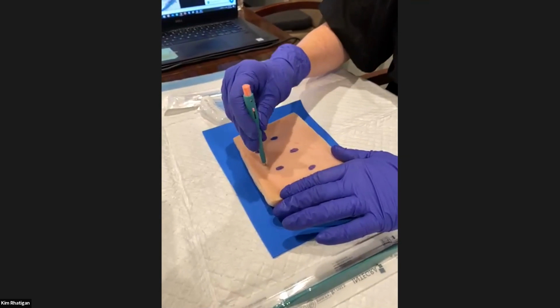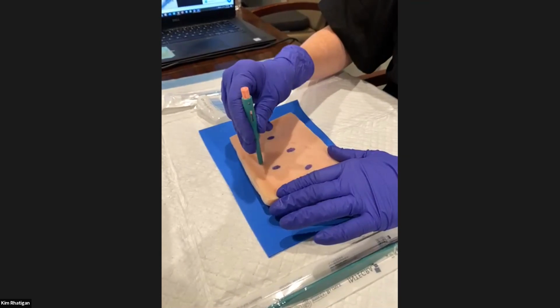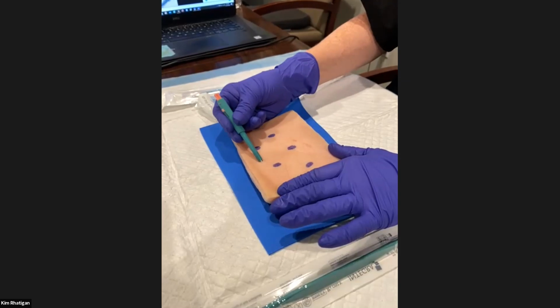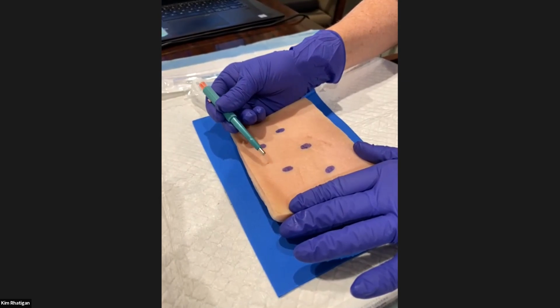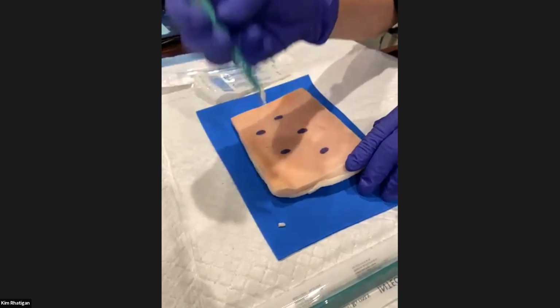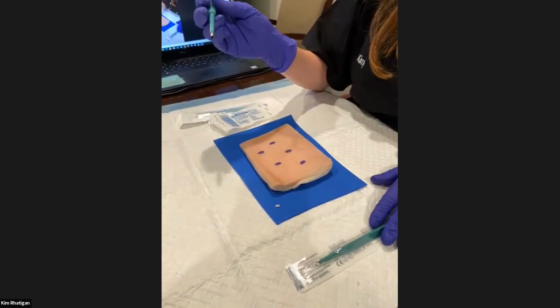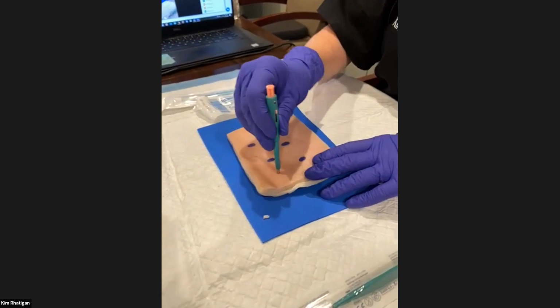As Dr. McClain stated, I'm going to rotate about 3/4 of the way down. I'm going to tilt 45 degrees, and then I'm going to withdraw this out. And here is my punch. Hi, Dr. McClain. 37.5 degrees. Oh, okay. The teacher is here. I have to redo my experiment. 37.5 degrees. So let's do it again.